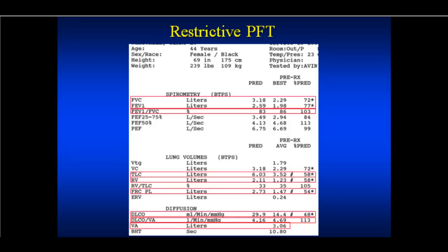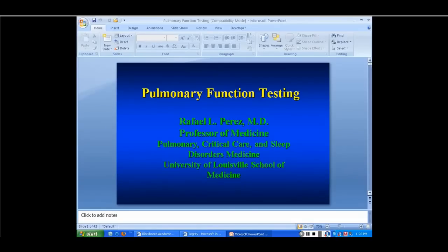When it does not correct up, and I don't have an example here, okay, this is telling us that there's some kind of mismatching or inequality. And in human pathophysiology, it's typically a vasculitis or chronic thromboembolic disease, something affecting the perfusion part of the lung. The capillaries, the capillaritis, it could be something higher up in capillaries. Something that changes your VQ matching is going to not correct up a restrictive impairment. All right? And that's the end. I'm happy to take any questions.